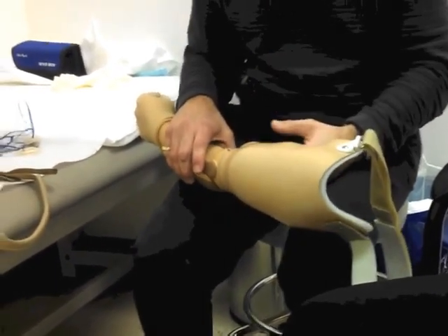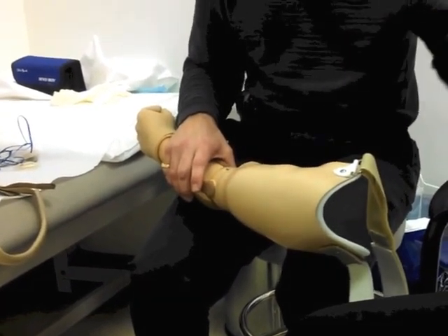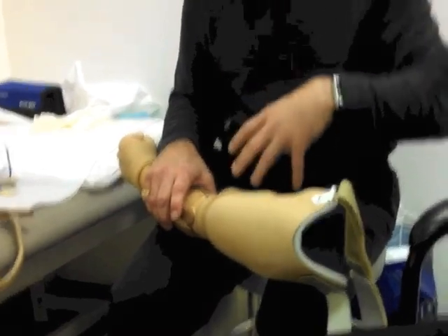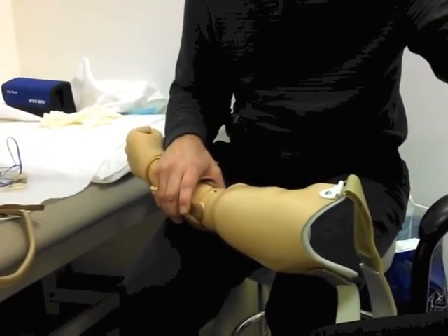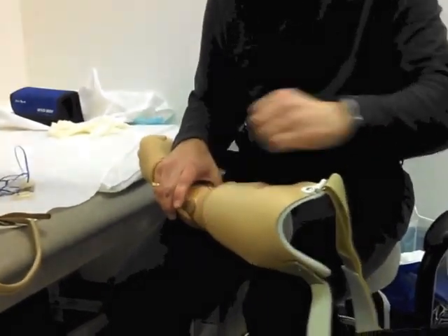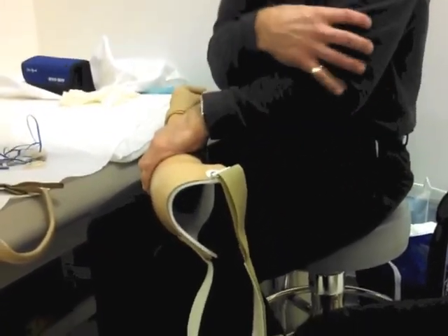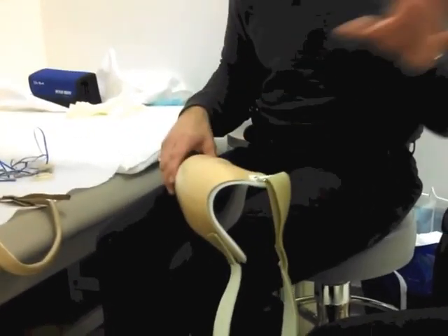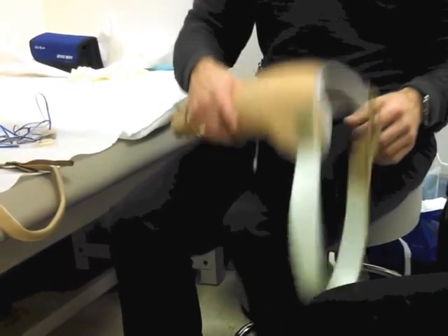The longer the limb, the better the suspension and function you get out of it. With a longer limb you can control it a little more — you have more leverage, more lean reaction. You've got more to hold onto. The shorter the limb, the harder it is. Sometimes we come up a little higher with the socket to compensate.